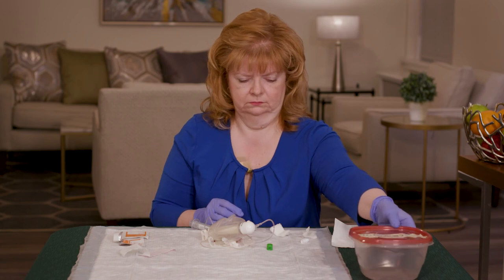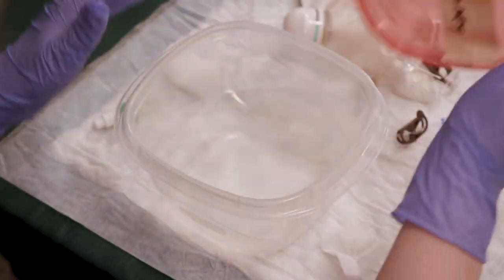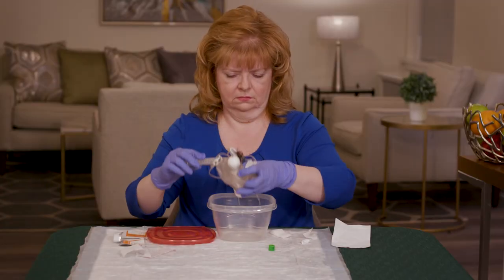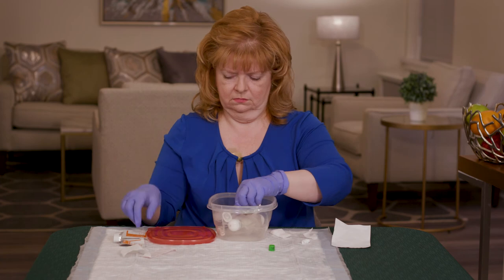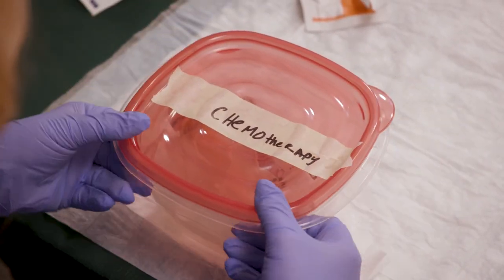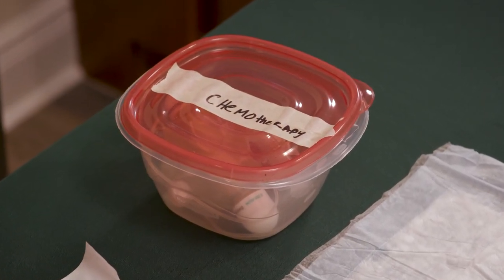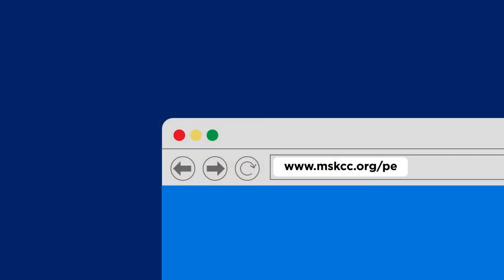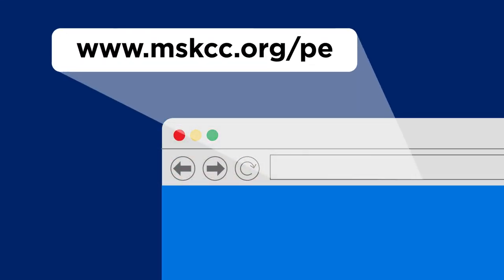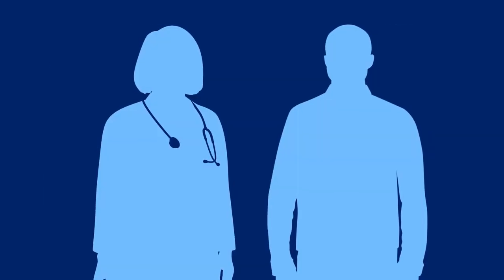Place the needle with the pump still attached and the empty syringe into the hard plastic container. Close the lid tightly. Bring the container to your next visit so your chemotherapy nurse can dispose of it safely. For more information, visit www.mskcc.org and search elastomeric pump. If you have any questions, call your healthcare provider.